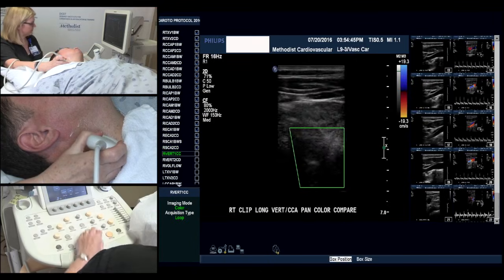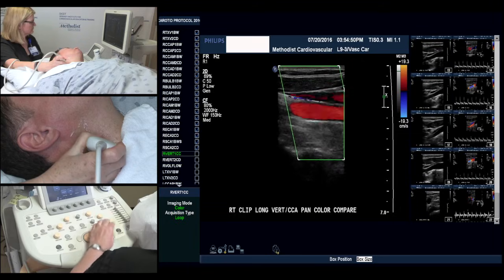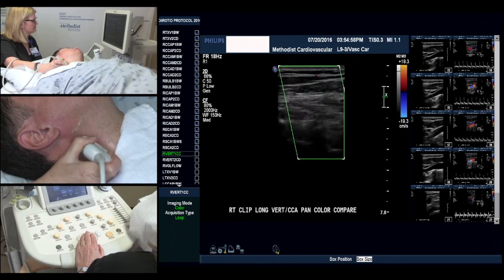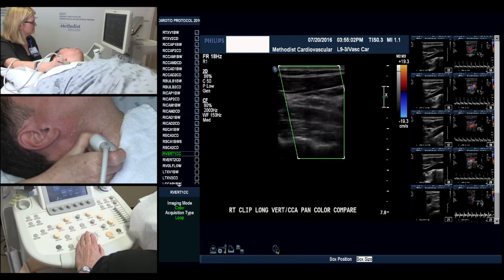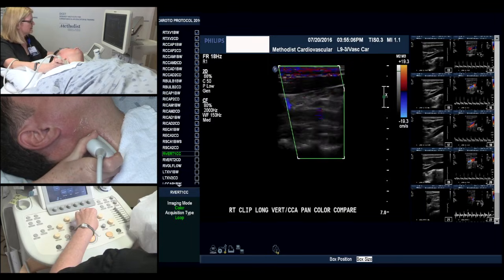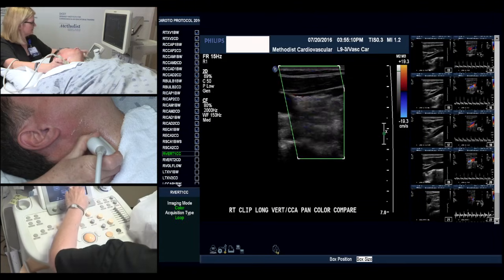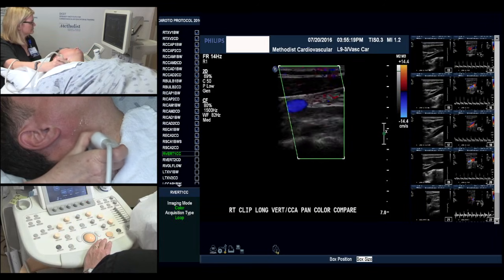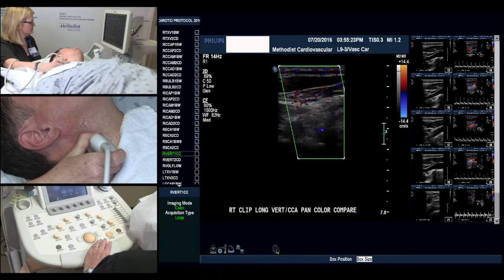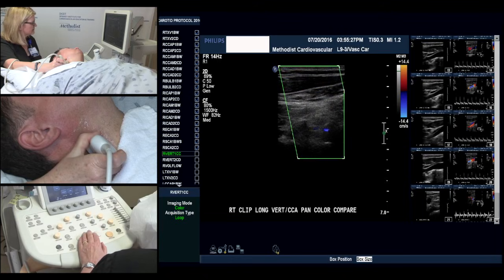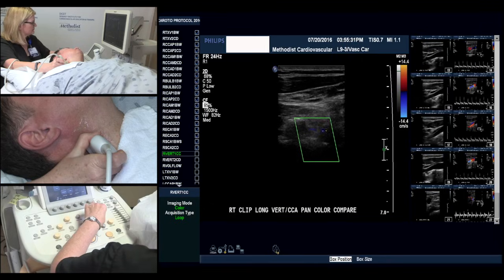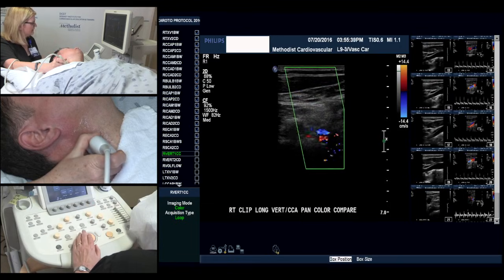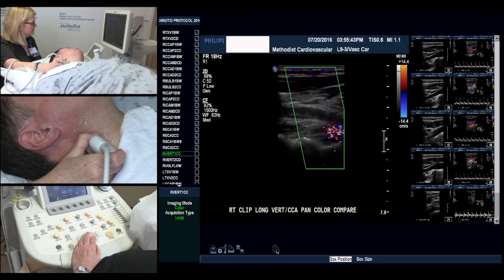From here we look at our vertebral artery. This is our common, and we'll pan down looking for the vertebral, adjusting focus and dropping our color scale. There are our vertebral bodies. I'm going to decrease our color box size, and there we have the blue vein above the artery, which is in red. We'll pan back to our common — we have red flow in our common and red flow in our vertebral.